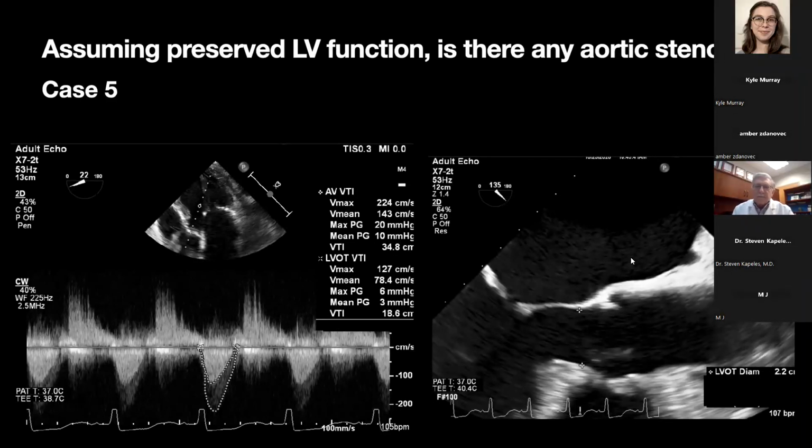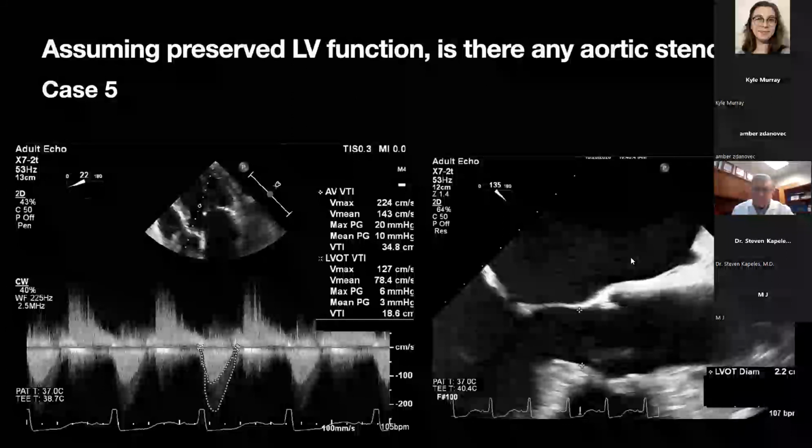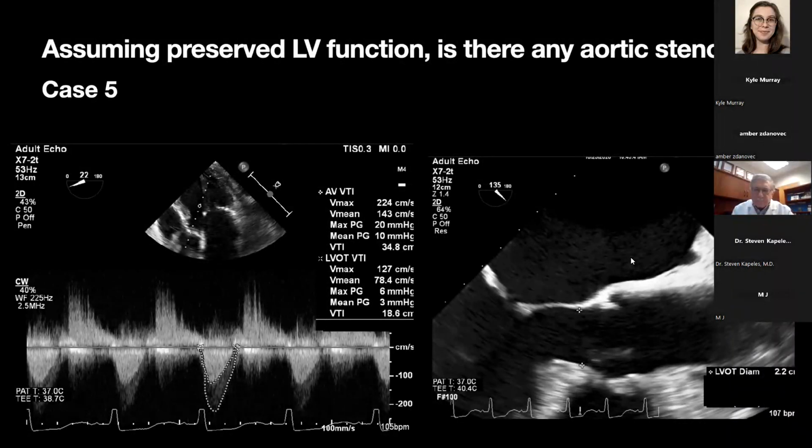You can also cheat like Pinkerton's doing right now, and look at some other things. Any chance to not have to do that? Or you can calculate some other things too, instead of the AVA, I guess.